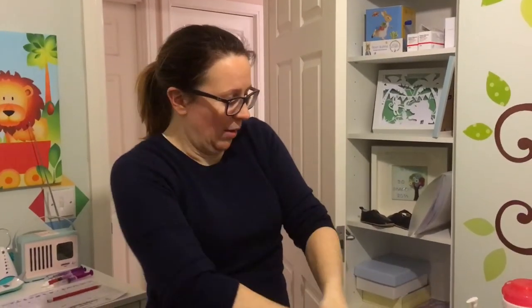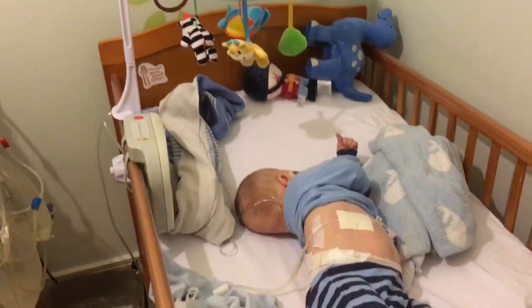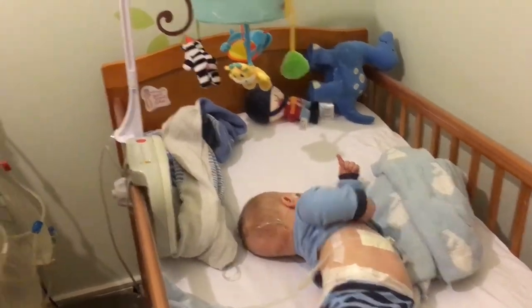So two minute hand wash done. I'm going to connect Ethan to the machine. Hopefully he looks quite tired today — he's rolled over and drawn to that side, which is very helpful for me, because sometimes when he's a bit wriggly it's quite difficult.